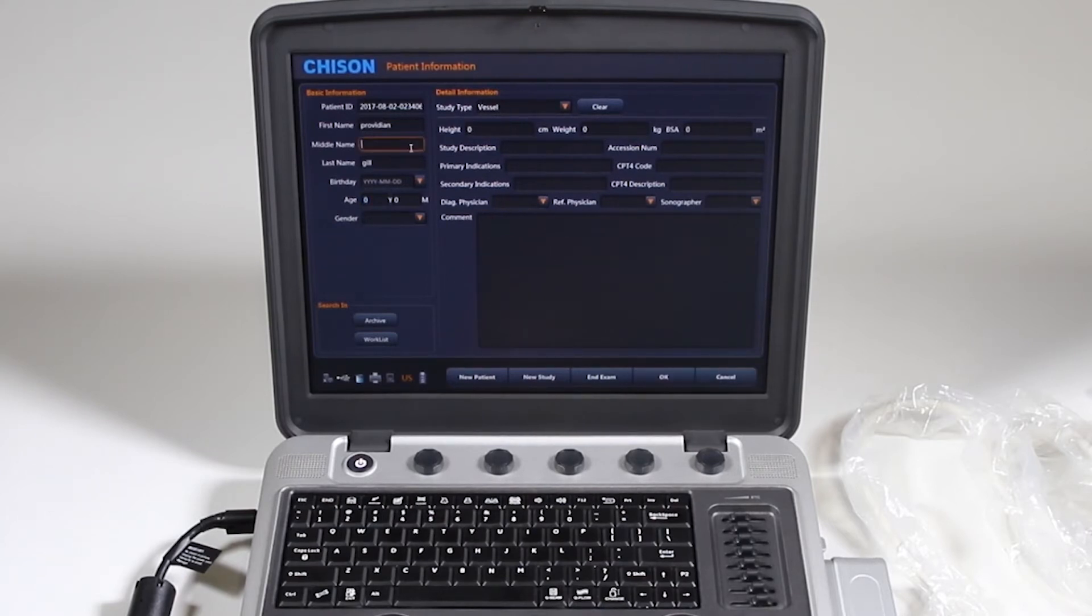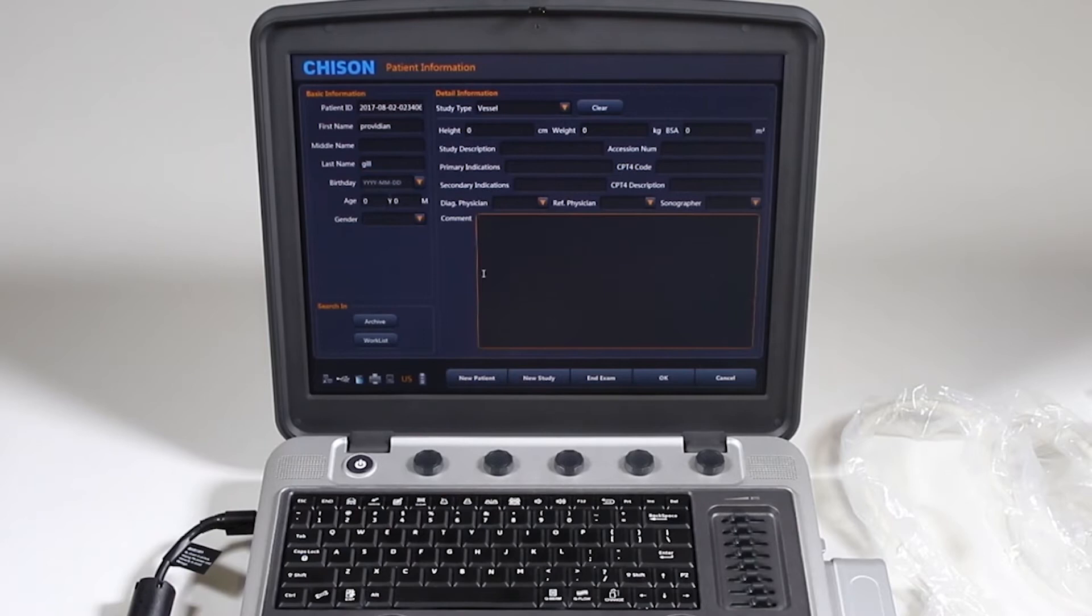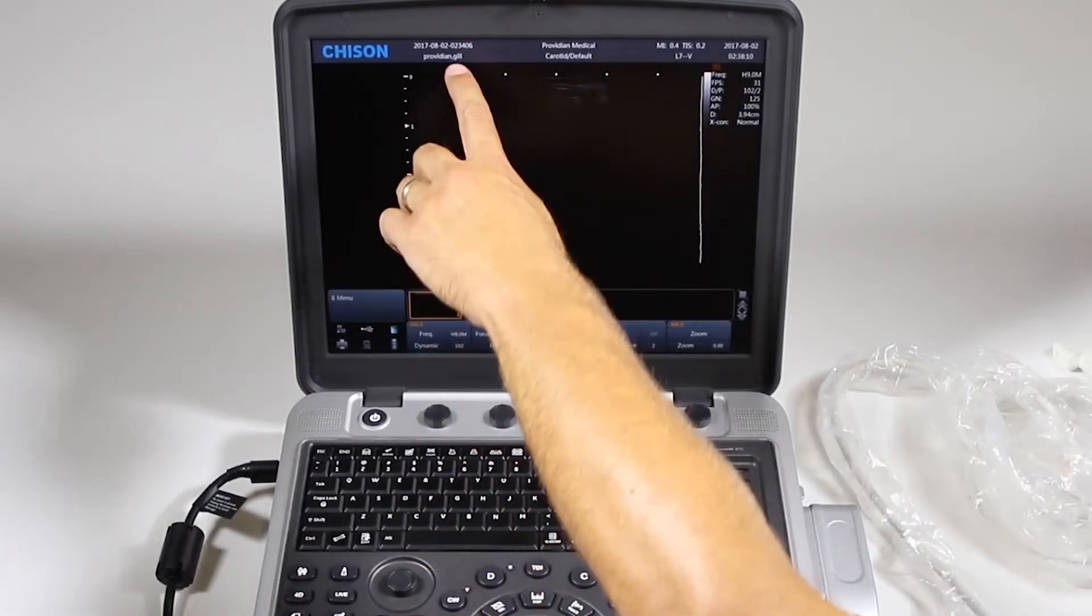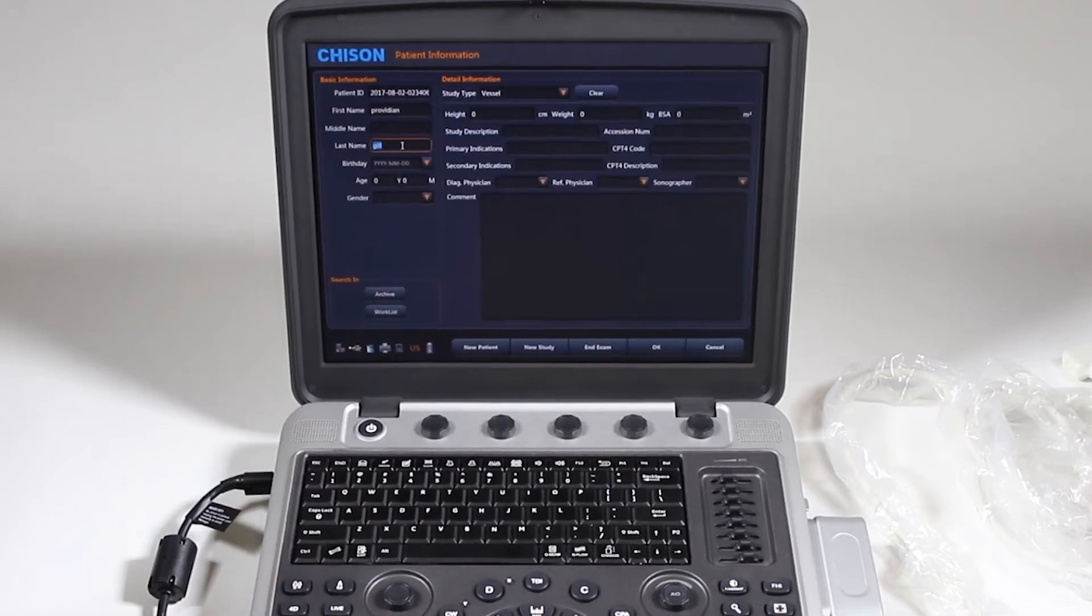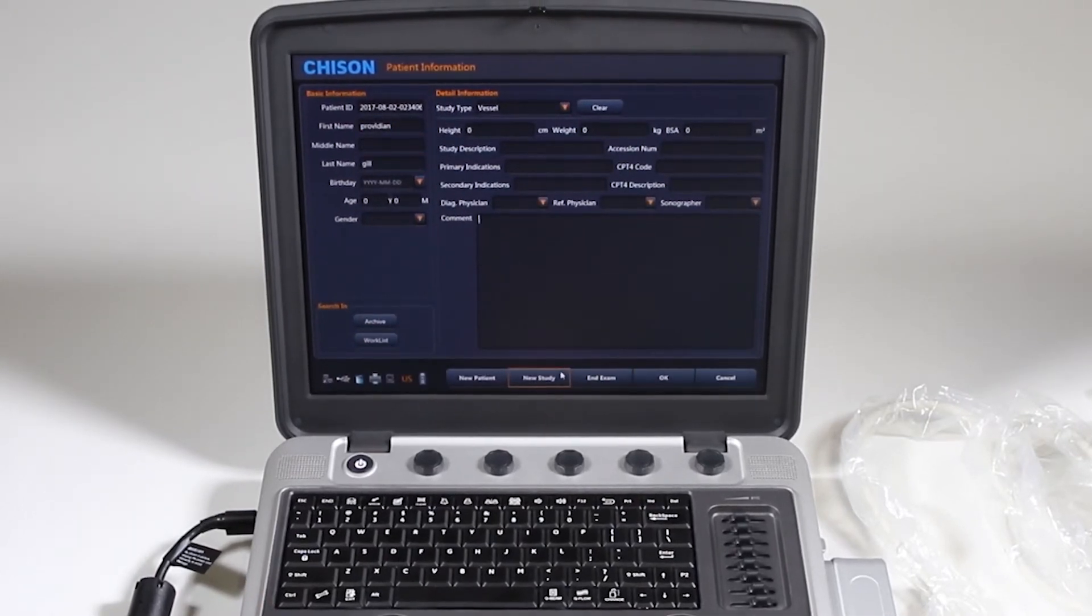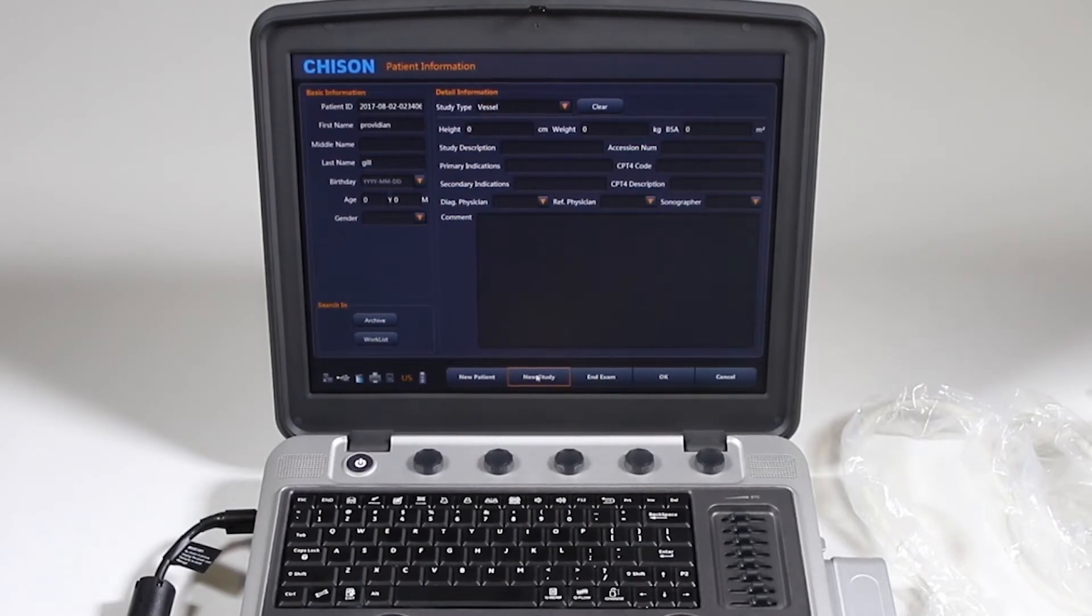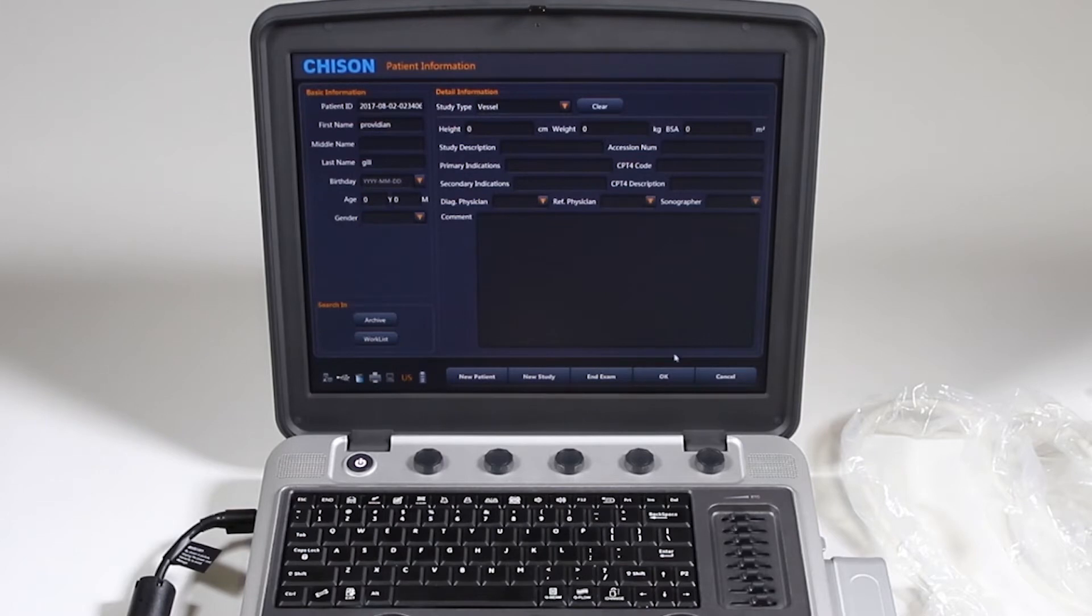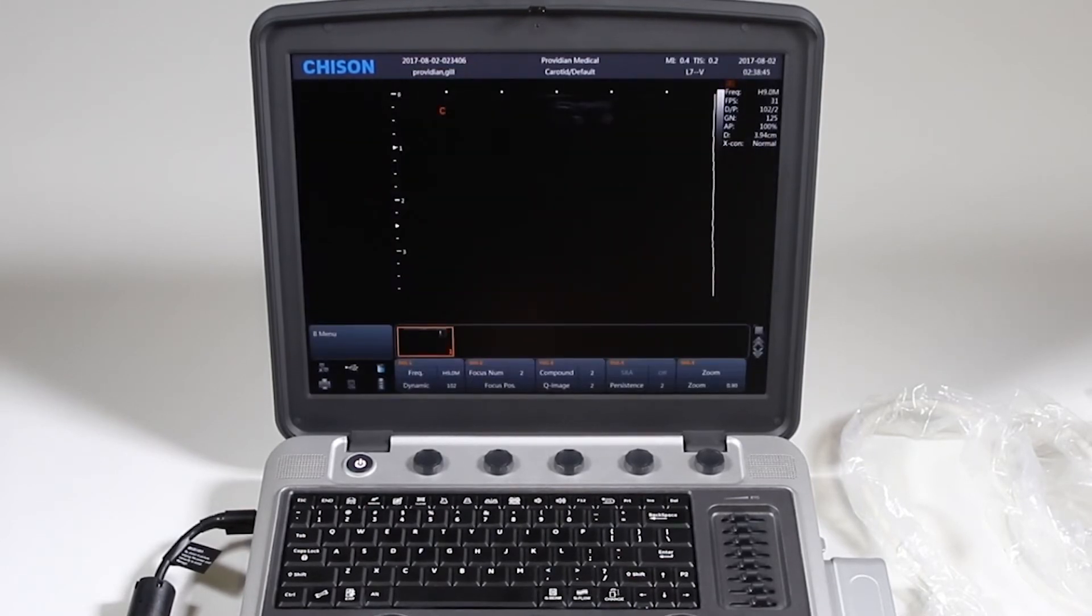So I just typed in this information here. If I go to new patient, it's going to erase that because it thinks that you're actually starting a new patient. But I actually want to add this patient. So I'm going to click okay. I'll come right back to this screen in just a moment. But I'm going to click okay and it'll register that patient in the database. Now when I go back, I can click new patient and it'll clear all these fields. Or if I selected that patient from the archive, I can click new study and it'll create a new study and you can add the study description with that same patient. You can also end this exam from the patient and of course okay and cancel. I'm going to go ahead and click okay and we can get started here.